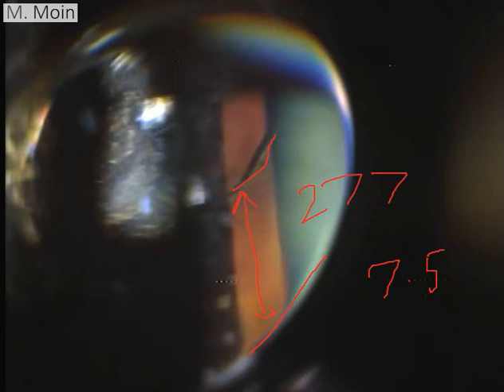And the next thing you want to see is, are the breaks on the buckle or not. So we go forward and let's look at the buckle. These are cryo marks which you see. Let me highlight those cryo marks once they become clear. I did cryo for those patients, and there is a residual area. So this is the area of cryo marks which you're seeing over here. This is actually the break, and these are the cryo marks. Let me move this forward slightly, and let's see if we can see those marks over here. So you're seeing this area of the buckle, and this is the temporal area with flat retina on the buckle.